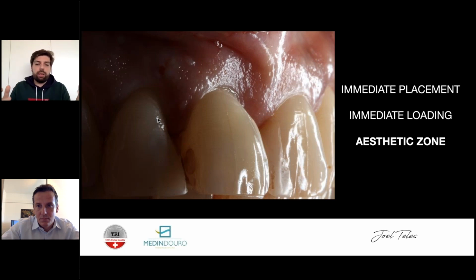It depends on many factors, and also on the width of your implant and the type of tissue you have. It depends on many things. But if you can use the 2 millimeter one, you should.